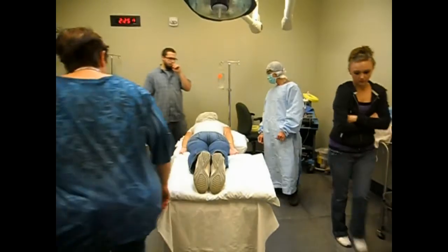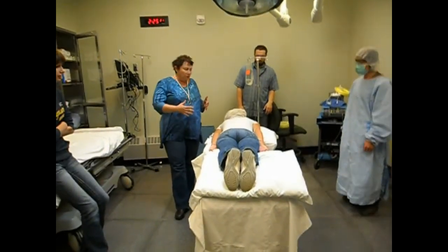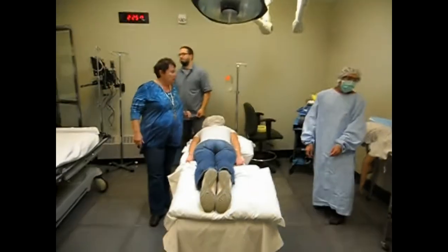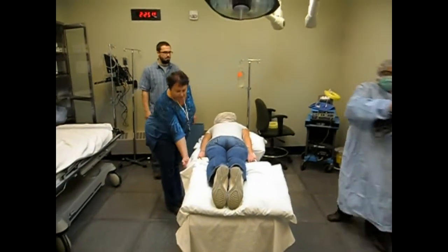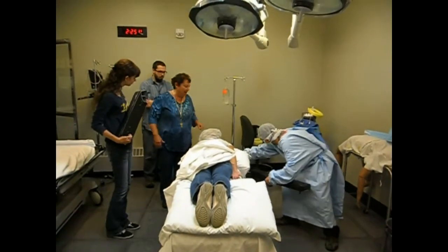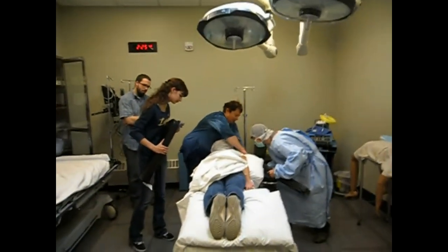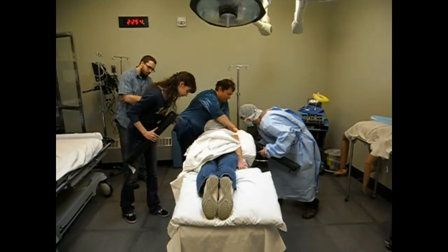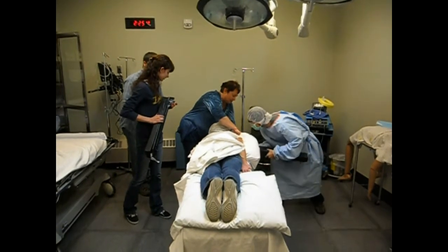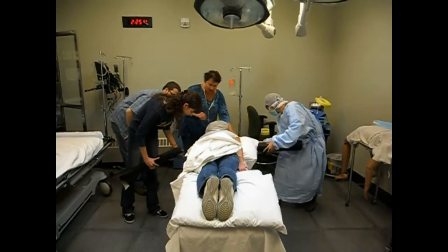Lastly, what we need to do is we're going to put arm boards on. And we're going to bring her arms out to the head of the bed. So we're going to in a minute, but we're going to get arm boards. So Fong, you can take that arm board and just put it on straight and then, you get it? And this is kind of difficult to do. No, that goes there. Yeah, no. Tilt it way, way up. Yeah. So this lip catches the bed. There you go. Way up, way up, way up. There. Now bring it down. It's got to like catch it.